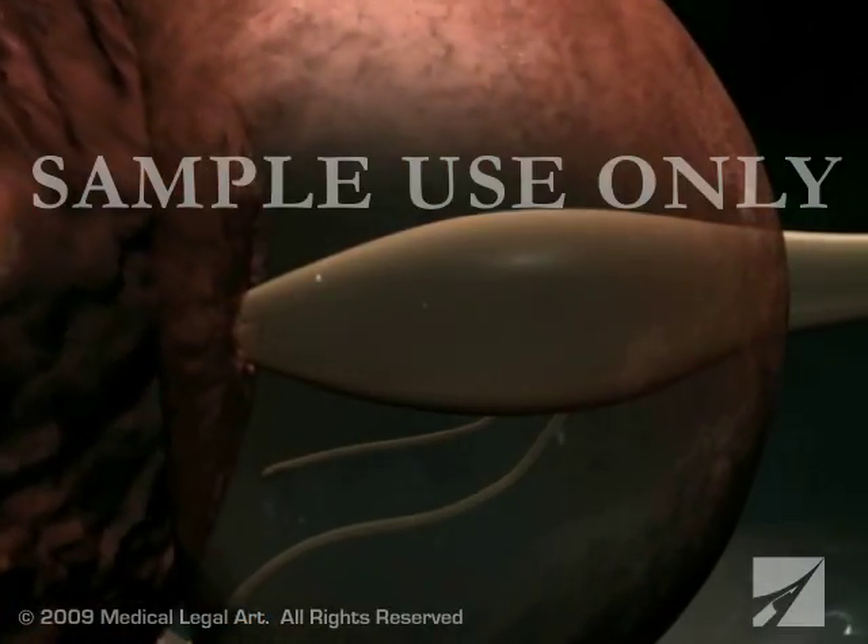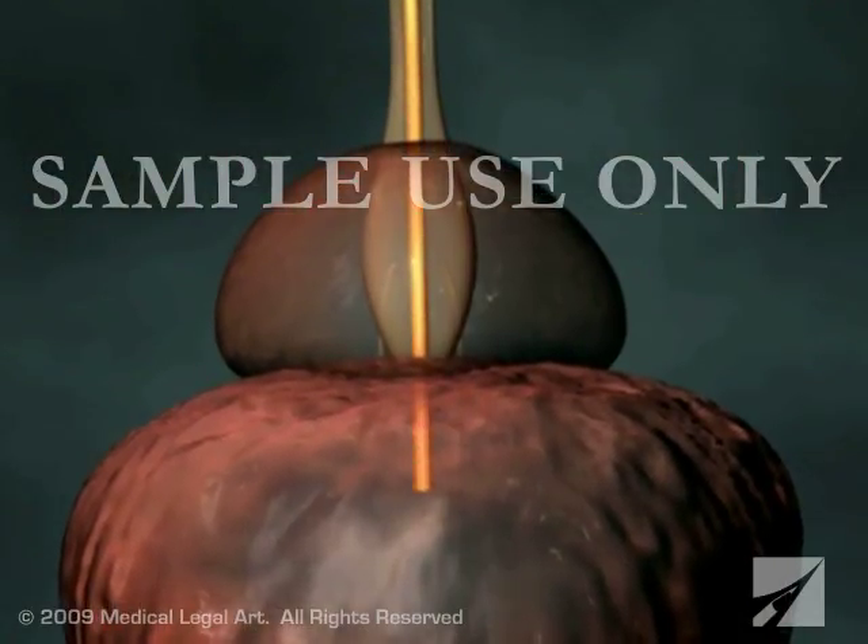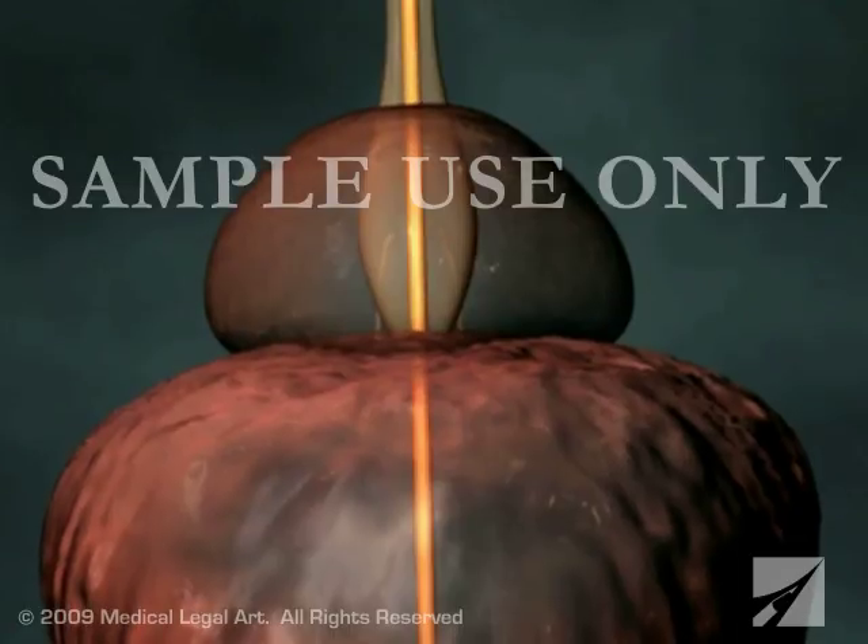When an optimal amount of prostate tissue has been excised, your surgeon will remove the cystoscope and place a catheter into your bladder to keep it draining for up to two days after the surgery.